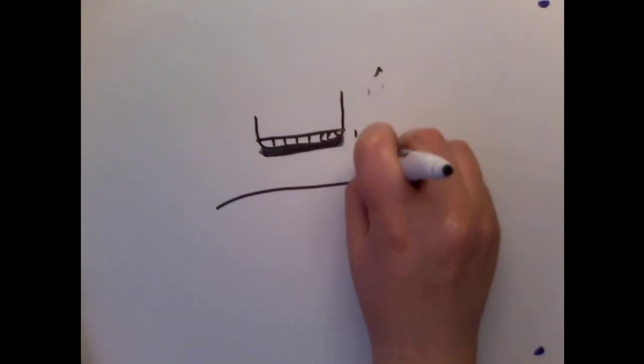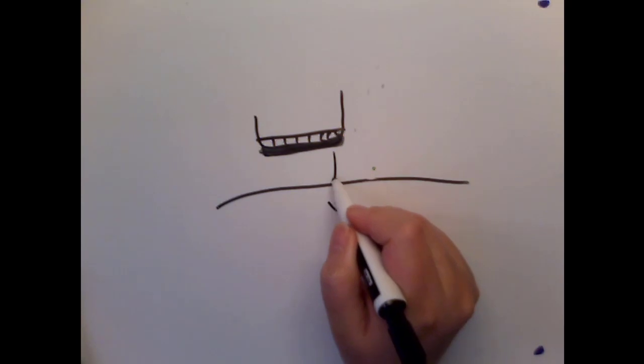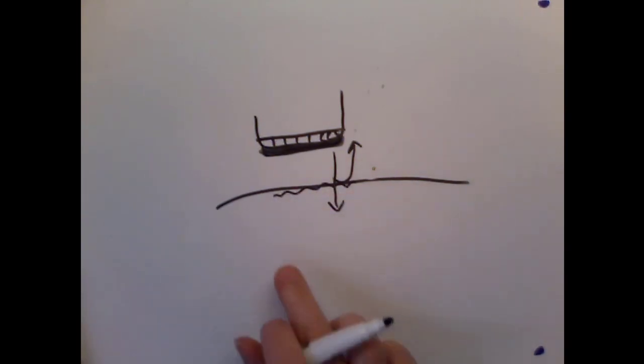Now that we have the matching layer in there, most of that sound is going to continue through with a little bit coming back to the transducer. And that's why we get some kind of fallout, speckly stuff right at the top of our screen.